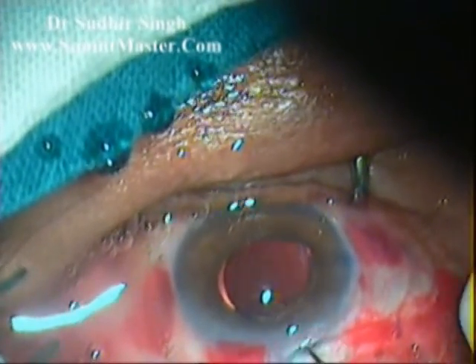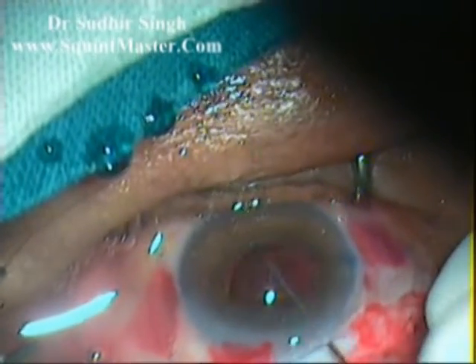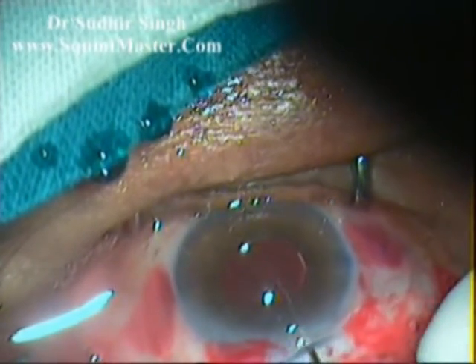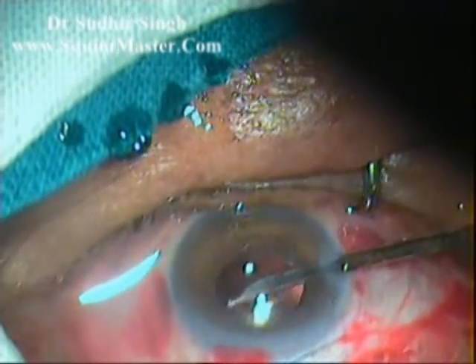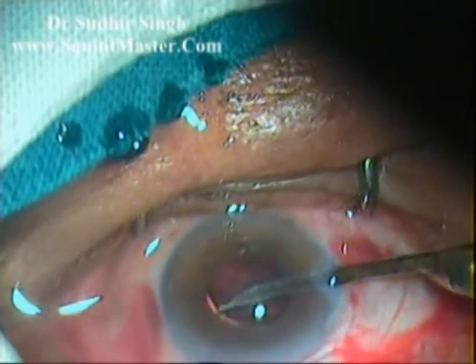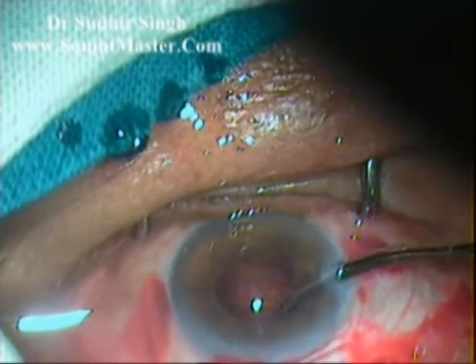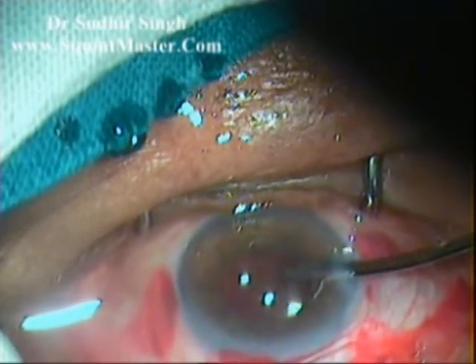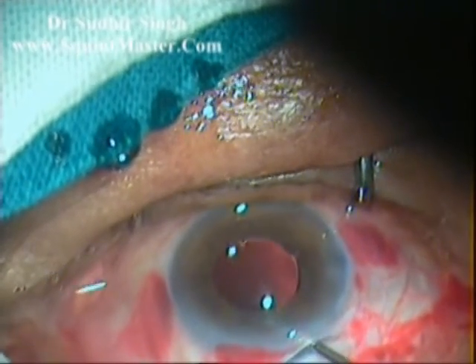The anterior chamber is formed with HPMC viscoelastic. A single-piece PMMA intraocular lens is implanted into the capsular bag. Remaining viscoelastic is cleaned up with a 23-gauge Simcoe irrigation cannula from the side port. The side port and main port are sealed with hydration.